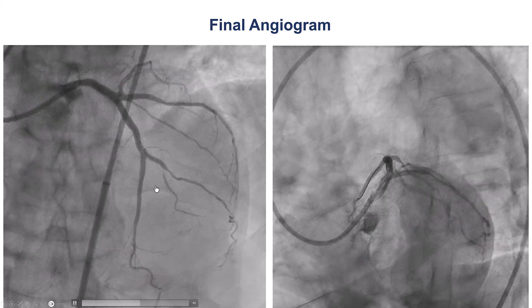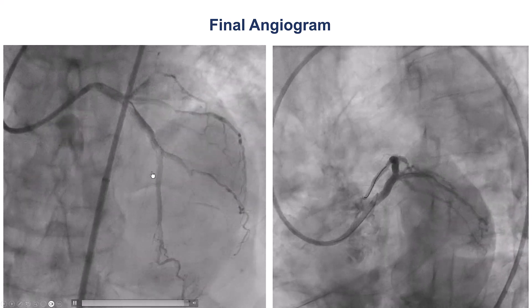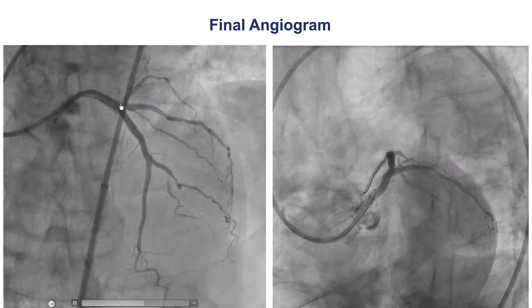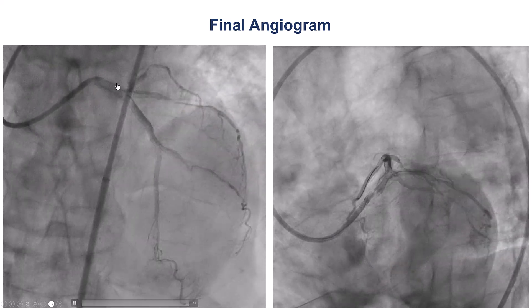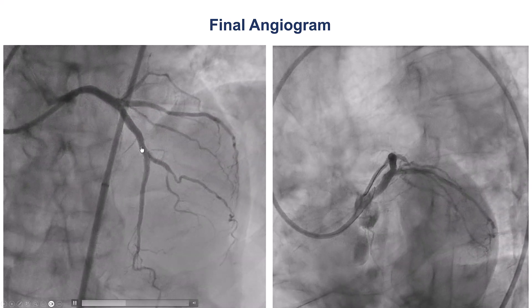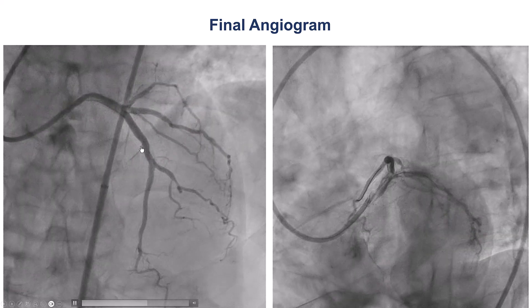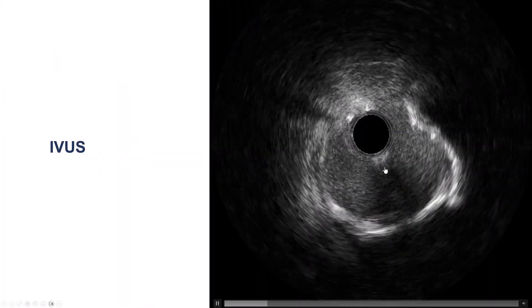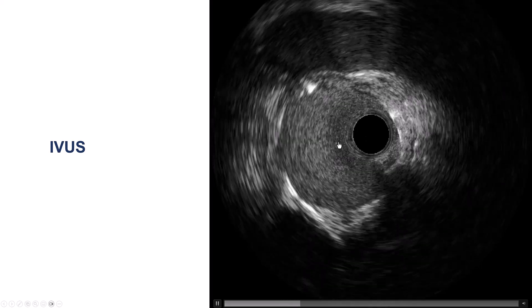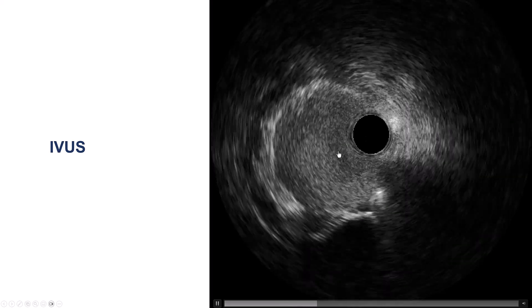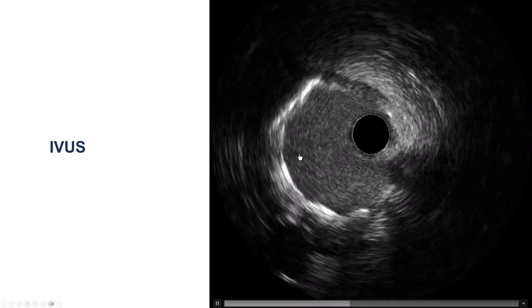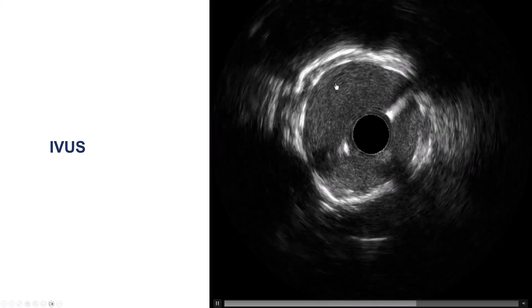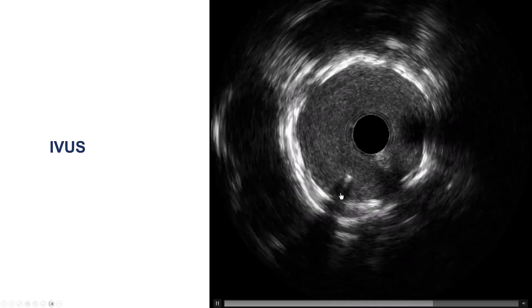This was the final result. Essentially two DK crushes were done — one in the middle LAD-diagonal and the other in the distal left main. Nice result with TIMI 3 flow in the diagonal, TIMI 3 flow in the circumflex, and TIMI 3 flow in the LAD. Intravascular ultrasound confirmed the stent was well expanded and well apposed to the wall of the vessel — overall a satisfactory result.